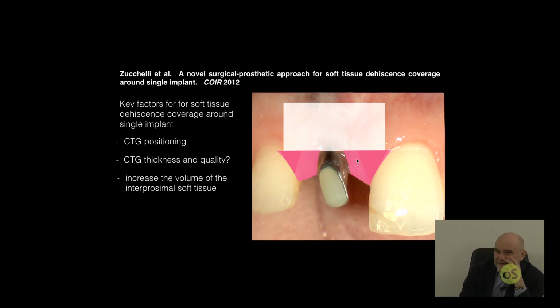So in no less than 2 months' time, this area is now completely filled with connective tissue that can be desepithelialized in the vertical, in the horizontal plane towards the palatal aspect, and give blood supply. To what? To the surgical papilla of the coronally advanced flap. And obviously, in order to make as much connective tissue surface in contact in the interproximal area, you have to prepare in your flap, that will be coronally advanced for sure, surgical papilla, which is always also trapezoidal.